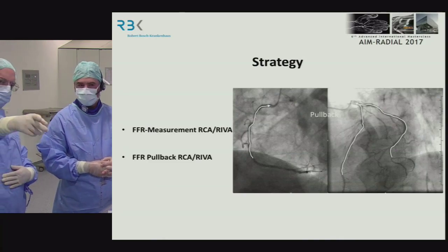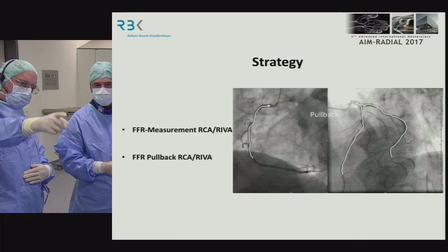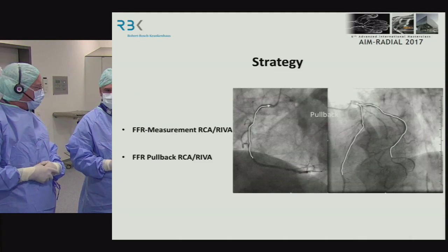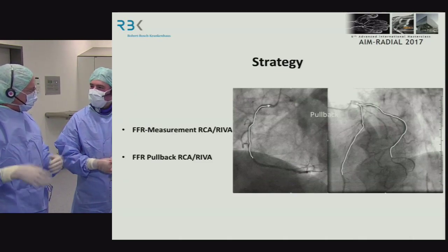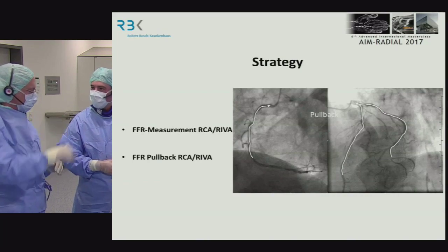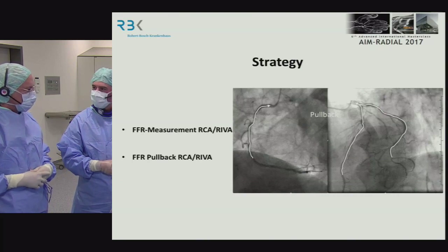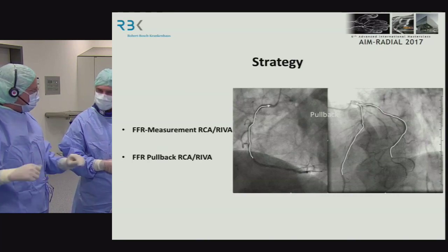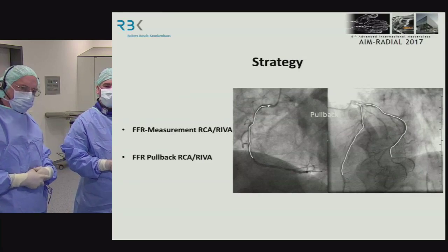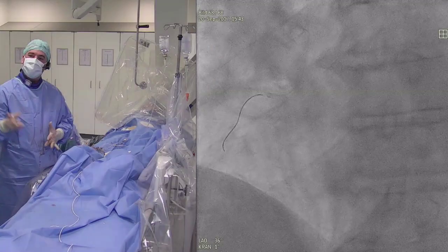And then the other thing that is not as evident in just this one frame is there's a pretty good right angle turn that you're going to need to get your wire to negotiate, and at least some of the wires out there have better turning capacity than others, and they're not, as a class, in general known for their easy maneuverability. So we'll see how this wire works down there. So perhaps we can go for the actual cath imaging. Can we see the actual imaging?